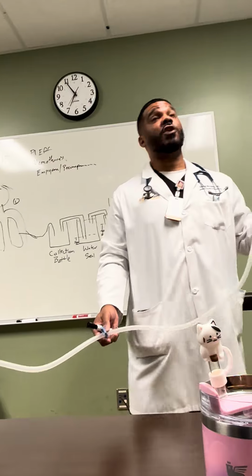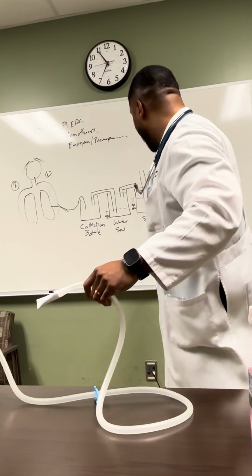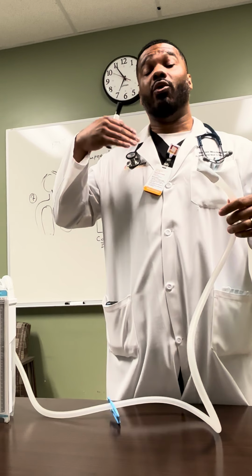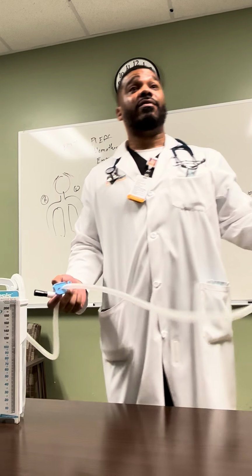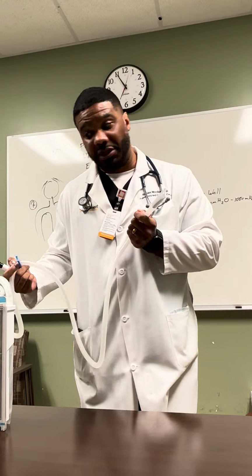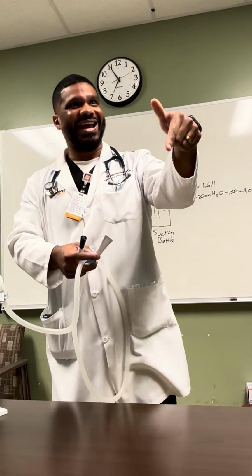We will start to wean the patient after a couple of days of the chest tube. What we will do is turn the patient off of suction, place them on water seal, and then we will probably repeat some imaging. If that looks good, then we will start our clamping trials where we clamp the patient, and it's almost like a chest tube is not in place. And if that looks good, then we liberate the patient from the chest tube. Sometimes we do the clamp that you see here. Sometimes there's a 3-way stopcock that we clamp. We should be communicating that with the patient.